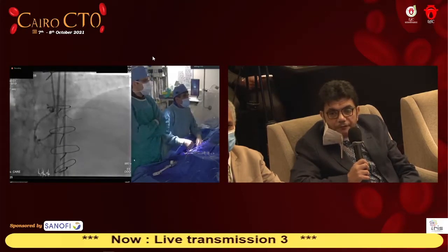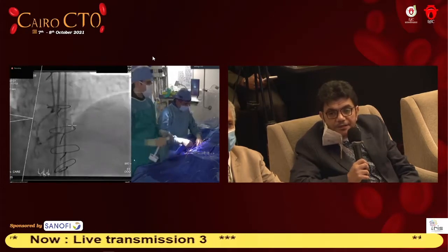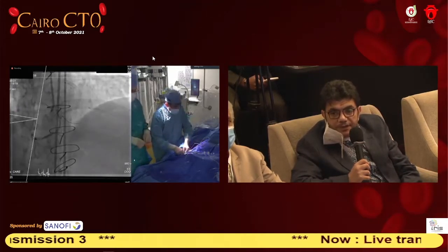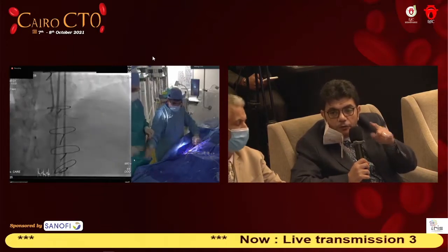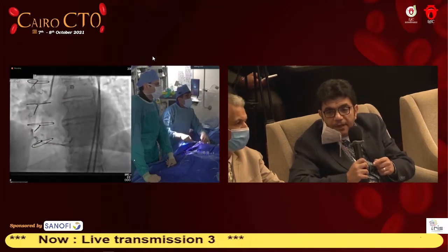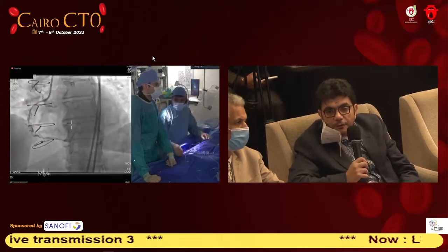Another factor, I thought, is the real insertion site of the vein graft. If the vein graft is very distal and carrying the PDA, and I go through the PL branch and the RCA, at that time I could leave my vein graft. The PDA would be well supplied by the vein graft, and the PL and all through the RCA will have antegrade flow.